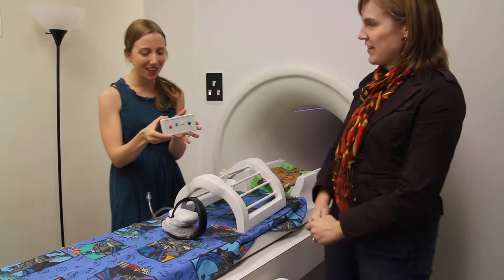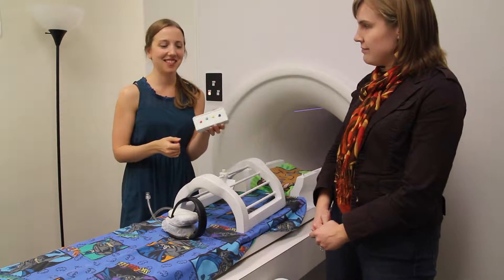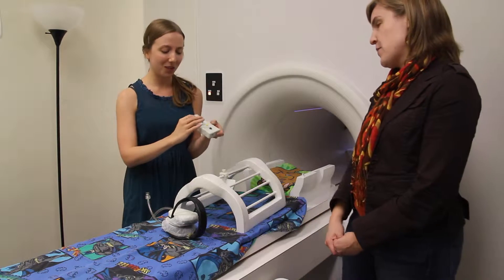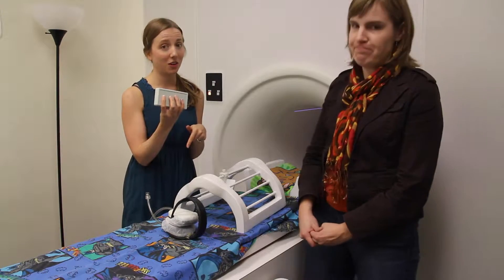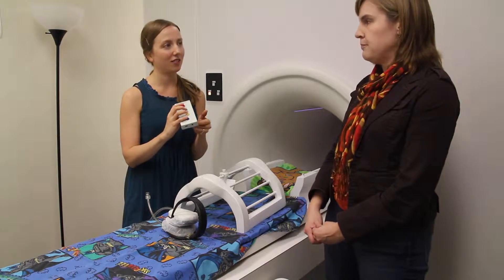Sarah's got one more thing she's going to take into the MRI scanner — this is her Nintendo 96, real old school. This is going to be the controller for the computer games that she's playing. The way these are designed is so that you can feel the buttons really easily with your fingers, so that you don't have to look at your hand while playing the computer games. That's important because you need to hold your head still — you can't be looking up and down the entire time.